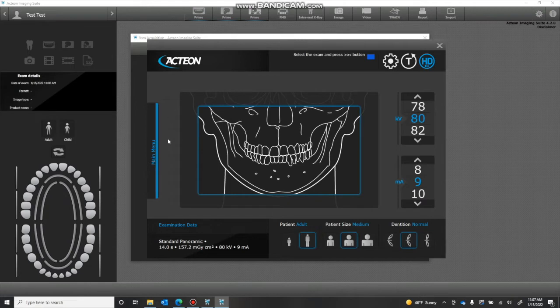So real quick, we're just going to go over the different modalities that we offer.